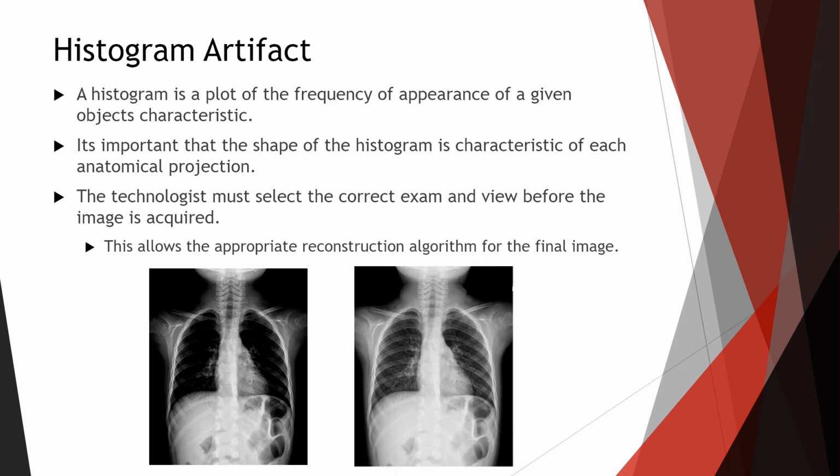And this is an example of selecting two different images, but exposing the same exact way. So the exposure is the same to both, it's the same patient, but there are two different images selected on the software. So during the reconstruction phase, it handled it differently. This is obviously not very acceptable here because it was expecting to see different data, okay, and it treated it a different way. And this is obviously probably the correct way, I would say.